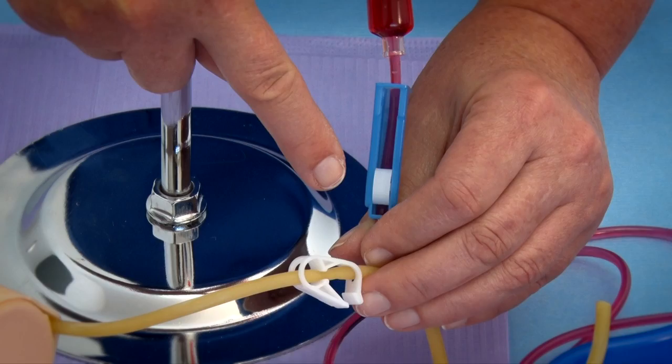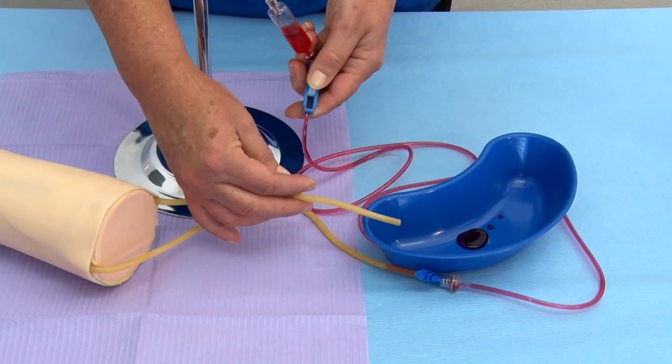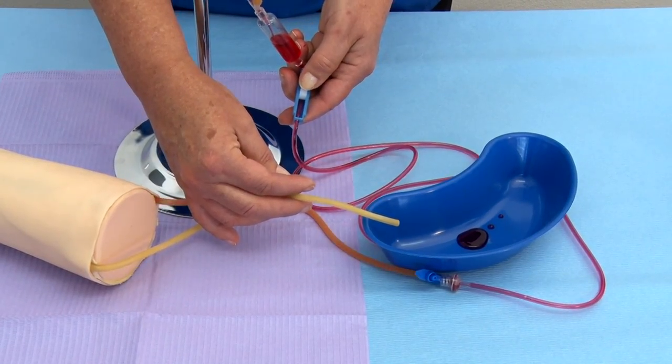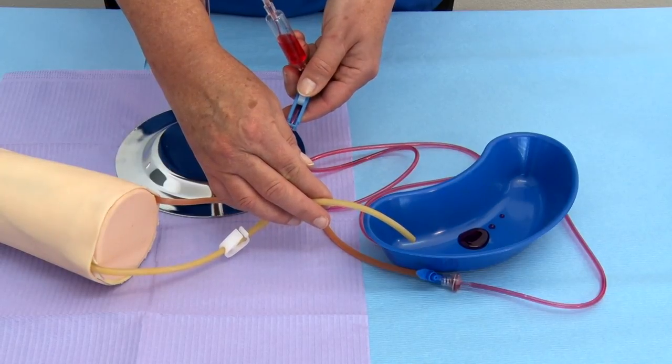Step 18: At this stage, the outflow tube roller clamp is closed and both arm tube clip clamps are open. Step 19: Place the small plastic container under the other arm tube and open the roller clamp, allowing the fluid to run through the arm tubes.